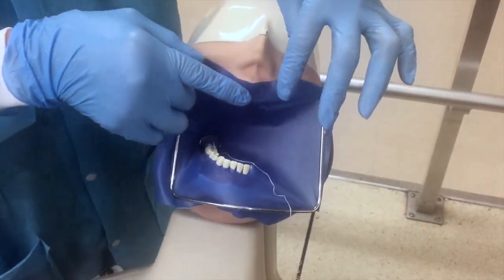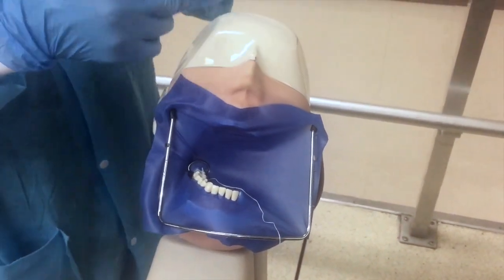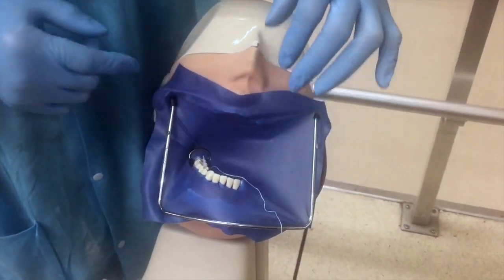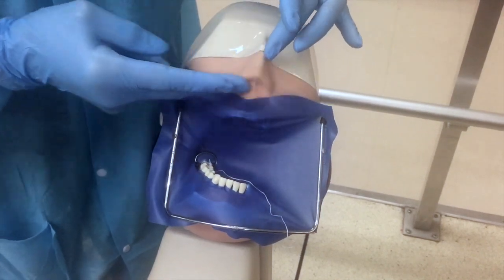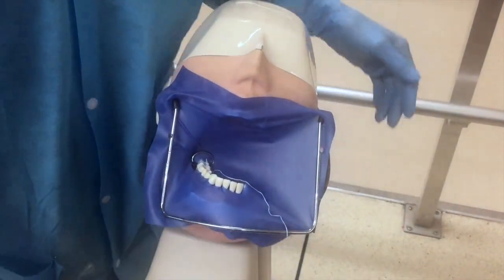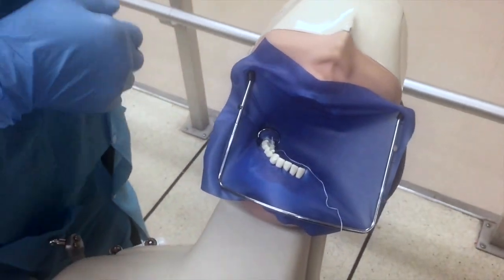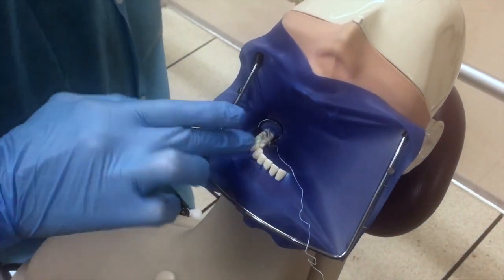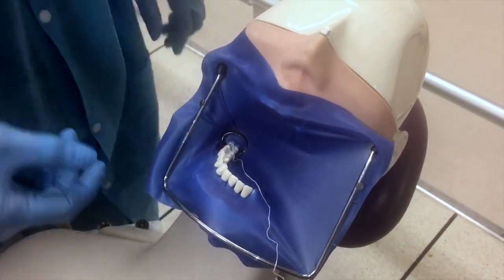Let's get the other prongs onto the rubber dam. That one tore a little bit, that's all right. And we're ready. Sometimes this rubber dam, after you put it on, it's actually on top of the patient's nose. That's not a happy thing for the patient. So you would just take a pair of scissors and cut so the patient can breathe easily.